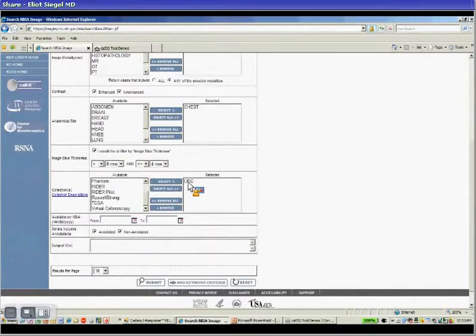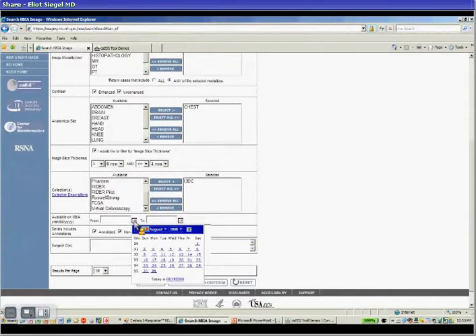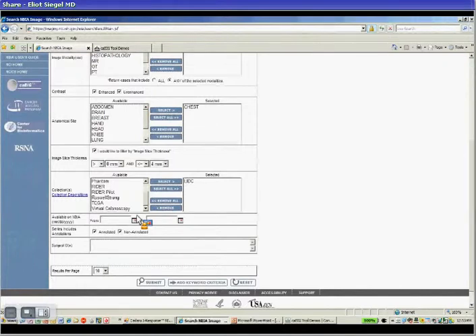The Osteoarthritis Initiative, phantom image studies, the RIDER and LIDC studies, and the studies from the Cancer Genome Atlas and virtual colonoscopy.